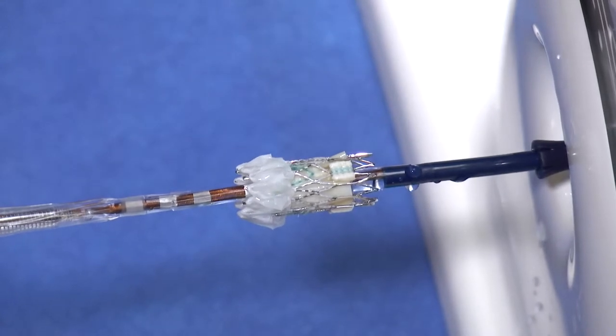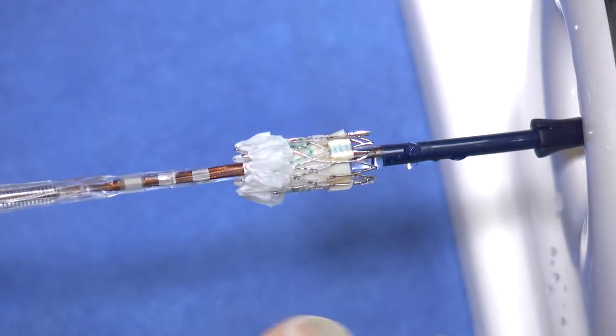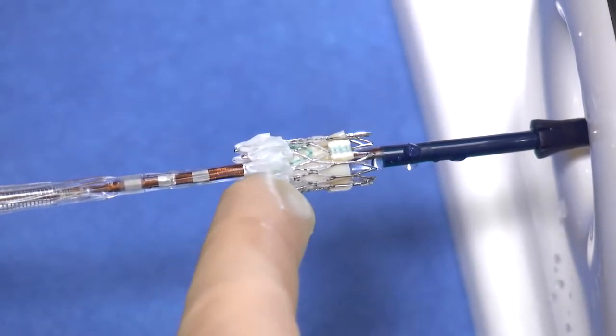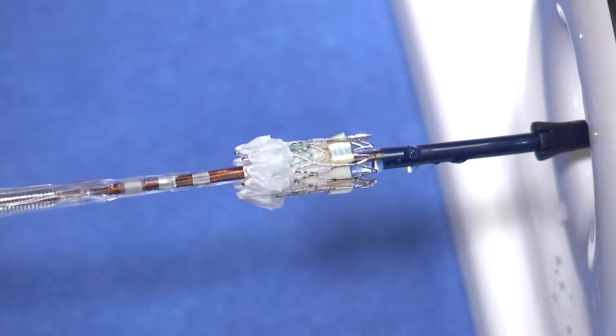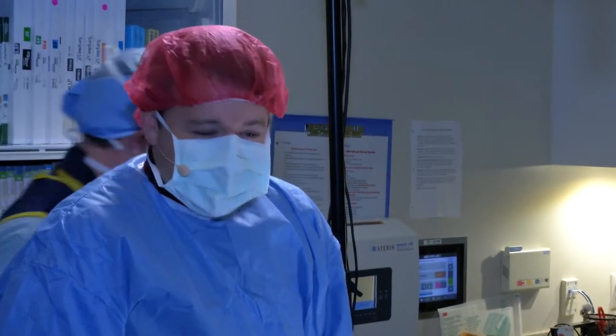And for a transfemoral case, obviously we want the skirt to be towards the tip of the catheter, because this skirt part of the valve will be in the ventricle. Having the valve in the wrong direction would be a very bad thing. So we always have two people confirm orientation so that there's no mistake there.